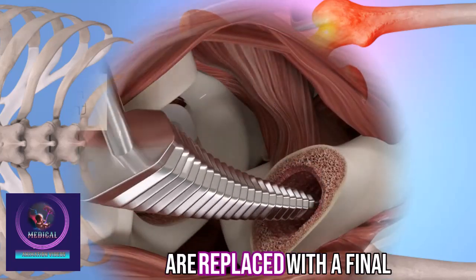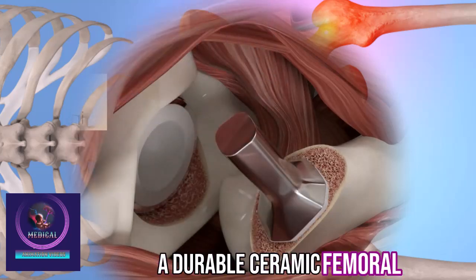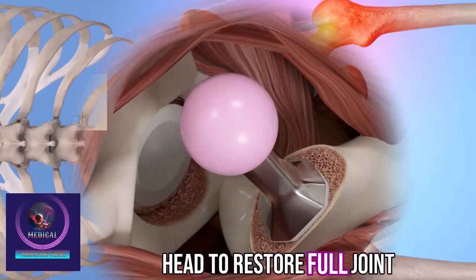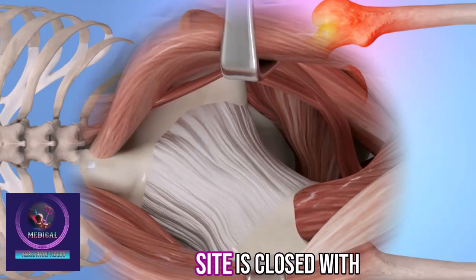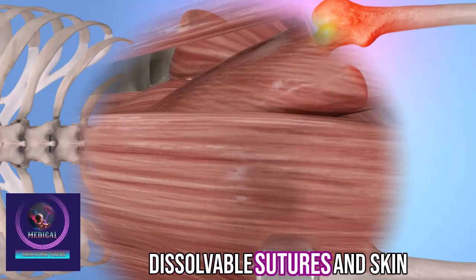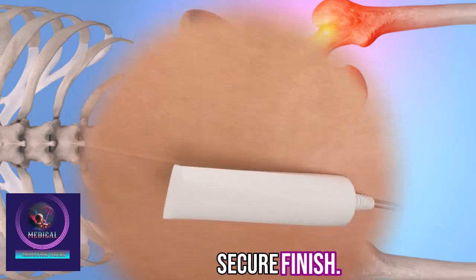After confirming the optimal fit, the temporary components are replaced with the final titanium implant along with a durable ceramic femoral head to restore full joint function. Finally, the surgical site is closed with dissolvable sutures and skin adhesive for a smooth and secure finish.